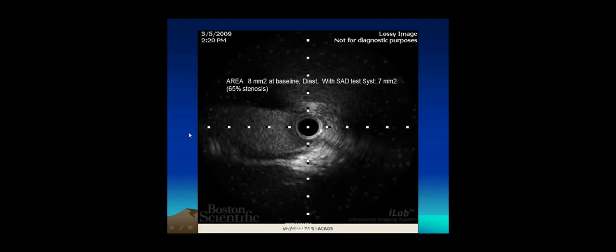You had the report on the other patient. You had the report on the MRI? Yeah, and the other, remember the other MRI? That's not an LGE picture we're looking at. It's a white blood picture. Okay. Because the blood should be nulled. It should be totally black. Okay, I apologize because I selected the picture and I thought that that was what he reported in the report, but in the report he called this a scar.